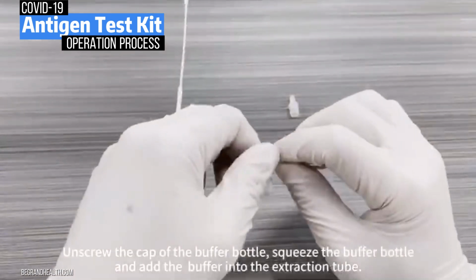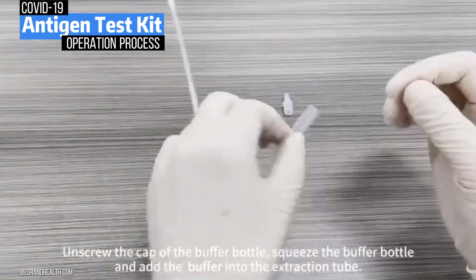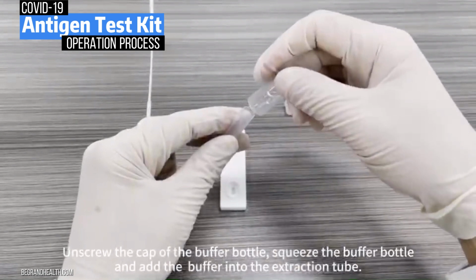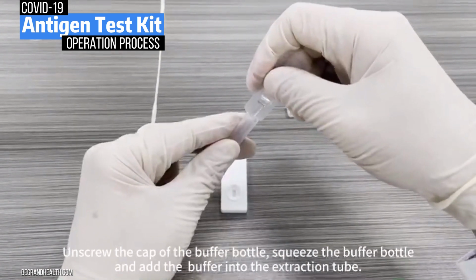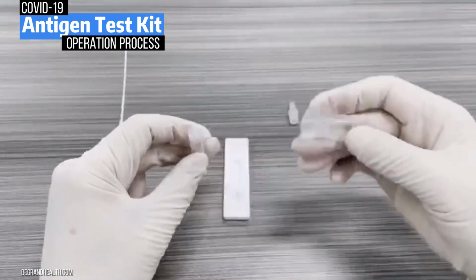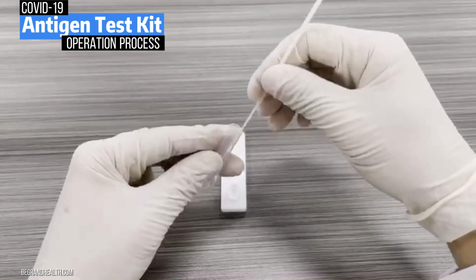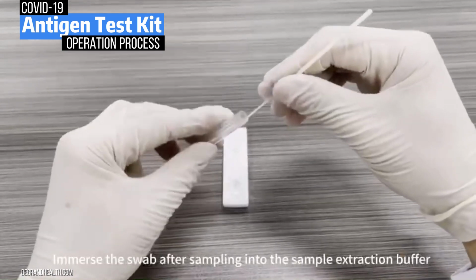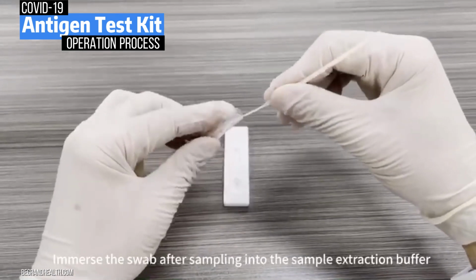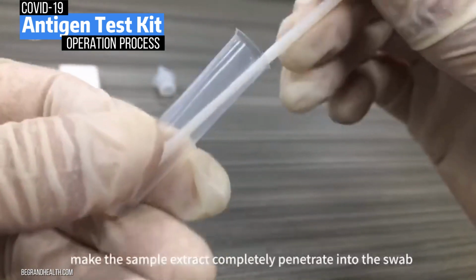Unscrew the cap of the buffer bottle. Squeeze the buffer bottle and add the buffer into the extraction tube. Immerse the swab after sampling into the sample extraction buffer. Make the sample extract completely penetrate into the swab.